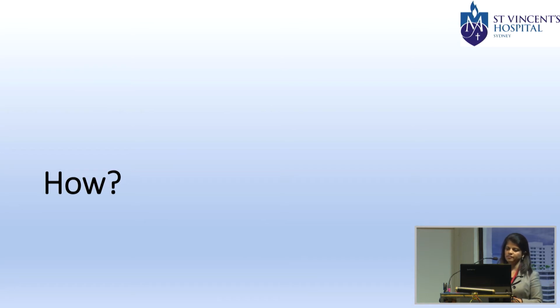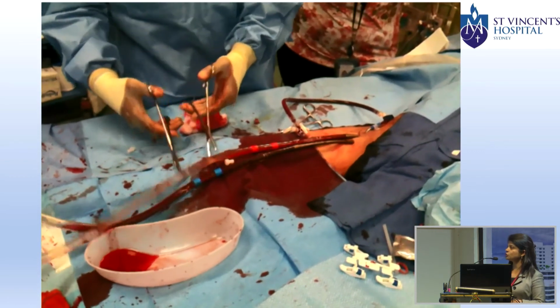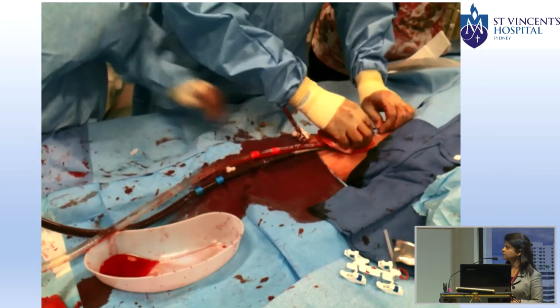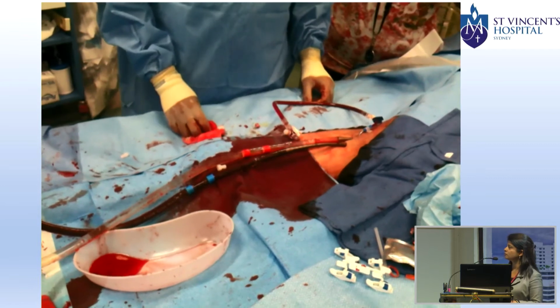So a little bit about the management, and I'll just show you a very short video there, and there's a question at the end of it, so don't fall asleep. So this is a patient going on to ECMO in our unit.